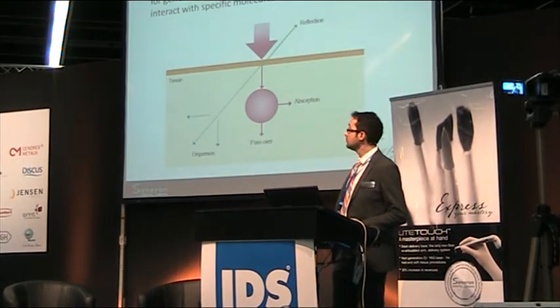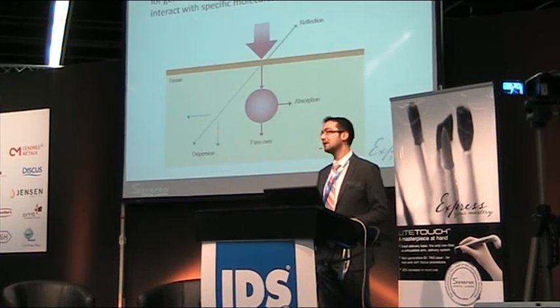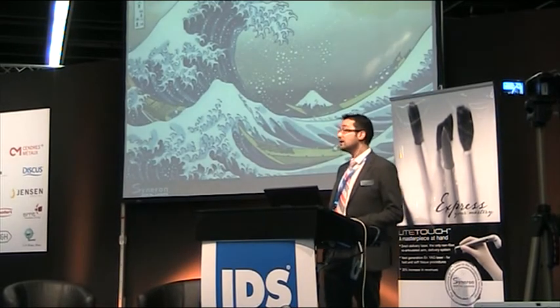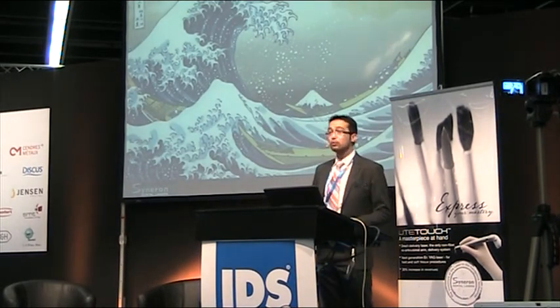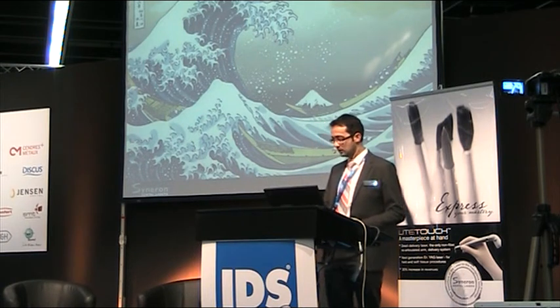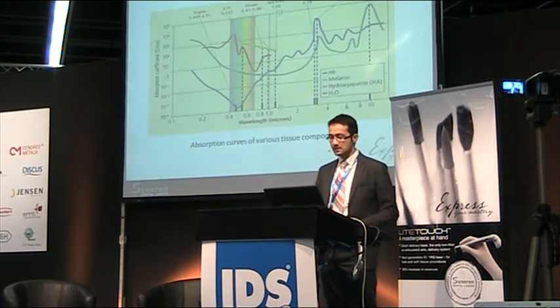Laser devices use a variety of physical media as a source of generating different wavelengths that interact with the tissues, and the major point is what wavelength we need. So to decide what to treat and how to treat it, we have to know some basics of laser physics.